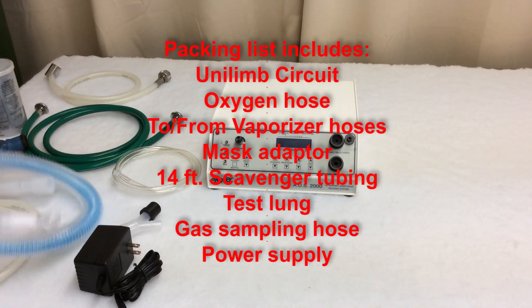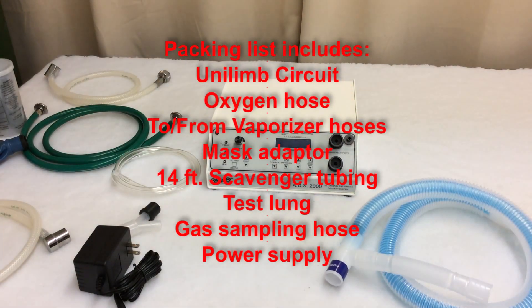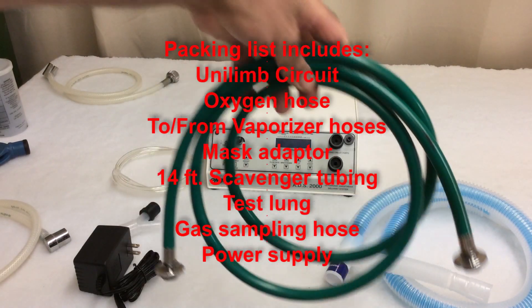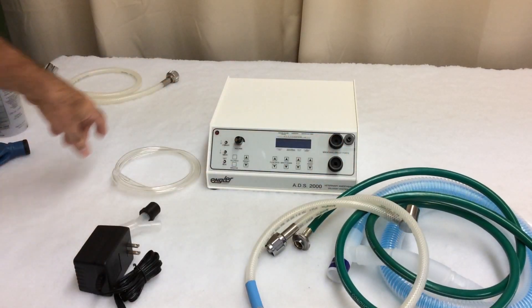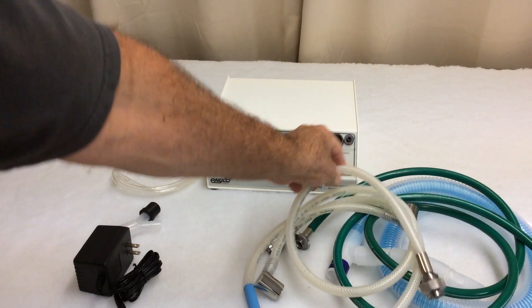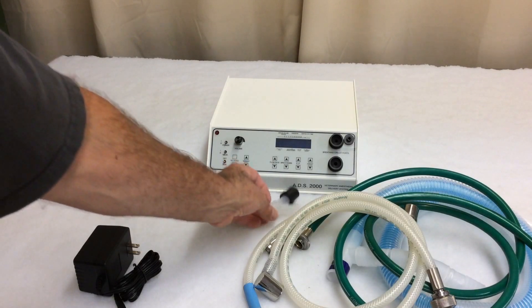Let's start with the Unilim Bain circuit that's included. There's the pretty standard oxygen hose, the to and from vaporizer hoses — these are silicone vaporizer hoses — and a mask adapter, which will allow you to mask your patient down.